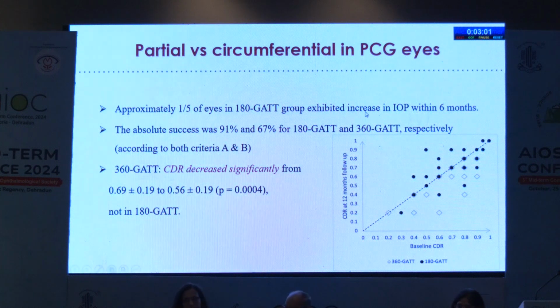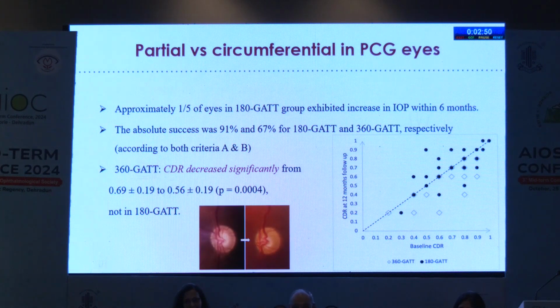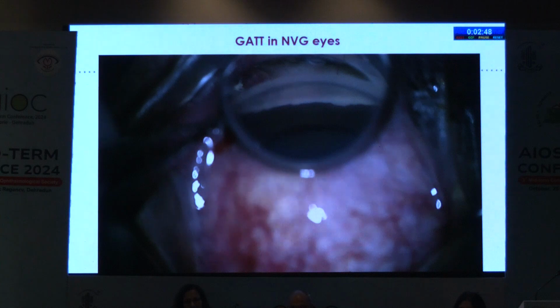Even when we looked at the CDR reversal, we could find that the post-operative reversal was better with the 360-degree group compared to the 180 group, which did not experience reversal with the surgery. So this is one of the optic discs showing reversal post 360-degree GATT.